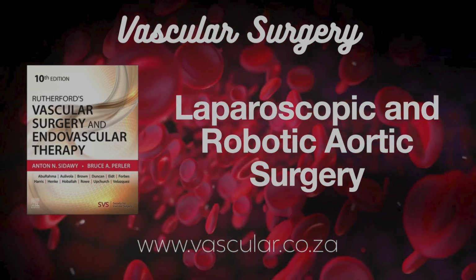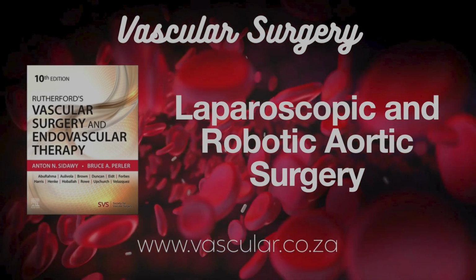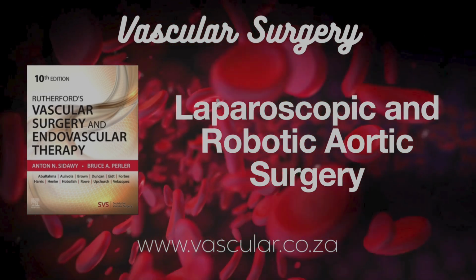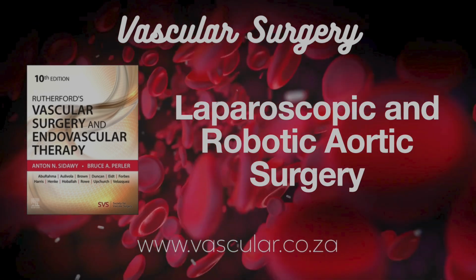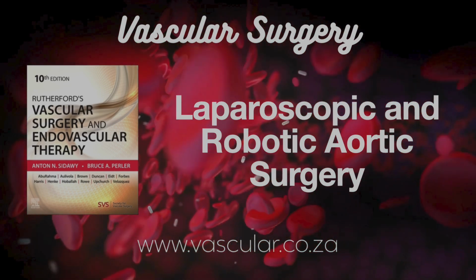They're usually put along the left side, maybe axillary lines, spaced out just right. Placement might even differ slightly for aneurysm versus occlusive disease. Interesting. And the robot itself is usually docked, connected to the patient ports from the left side of the table. It's all about the geometry.